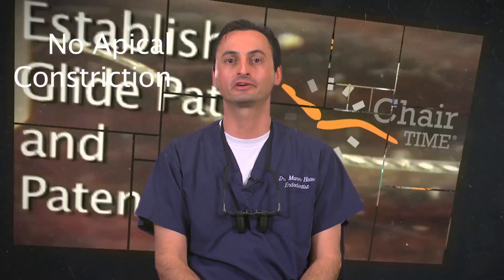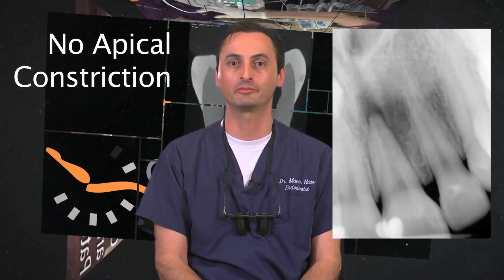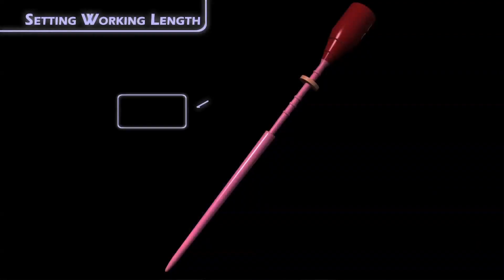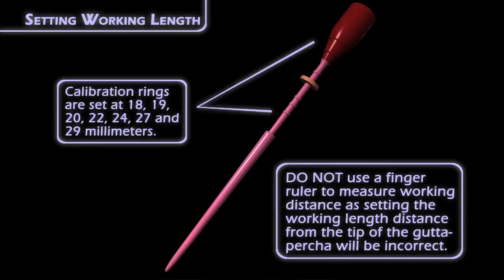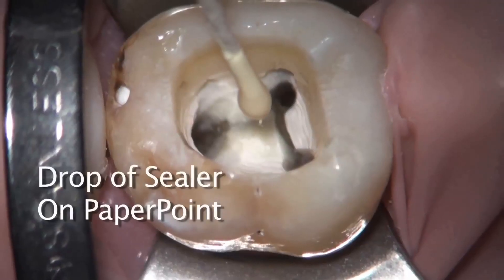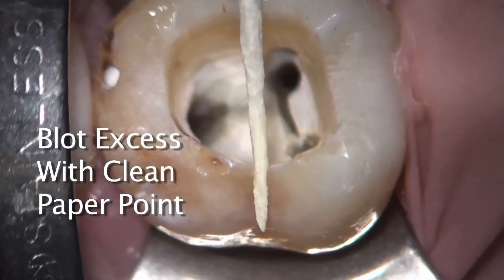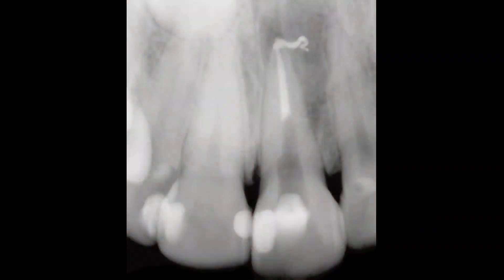Second, I'll speak about canals with no apical constriction. These include, but are not limited to, cases with apical pathology or canals that have been instrumented large beyond the apex. In such cases, I recommend that you obturate at least one millimeter short of your working length, and remember to use very little sealer in these canals. This will help reduce extrusion of sealer and/or gutta percha. This case of mine — a maxillary central with an apical lesion — demonstrates how using too much sealer and/or not filling short of the working length could result in unintentional extrusion.